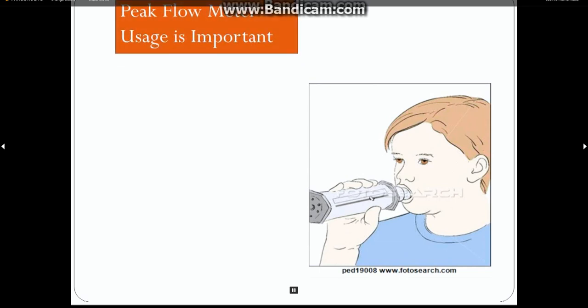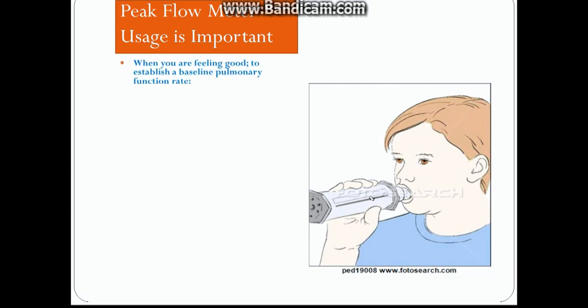Now we're going to talk about the peak flow meter. This is a very important tool that's used to help you monitor how your lungs are doing when you're having an attack and when you're not having an attack. So let's learn how to use the peak flow meter.